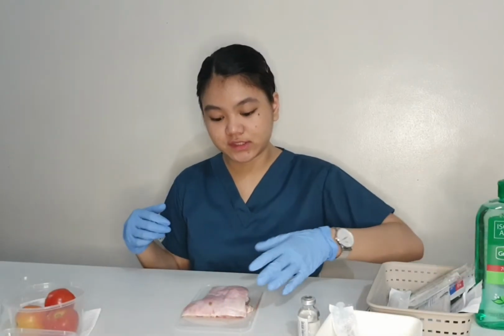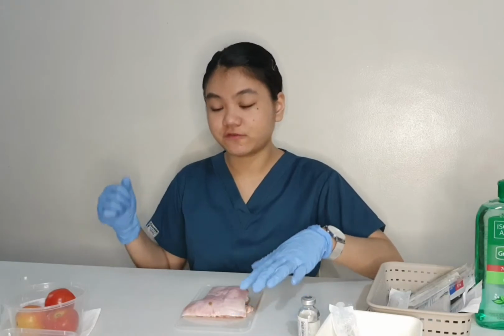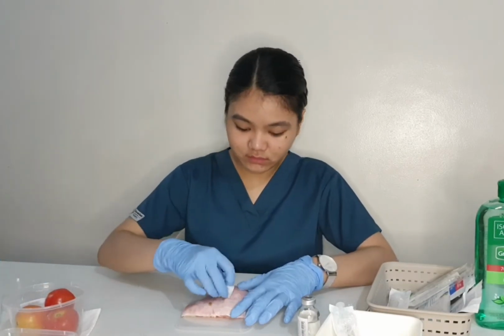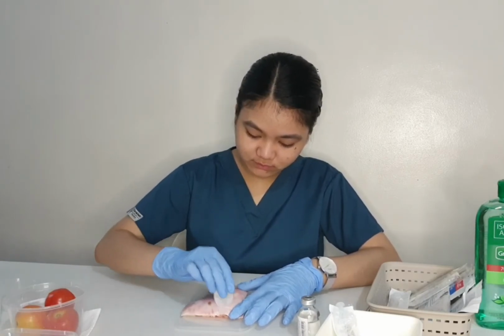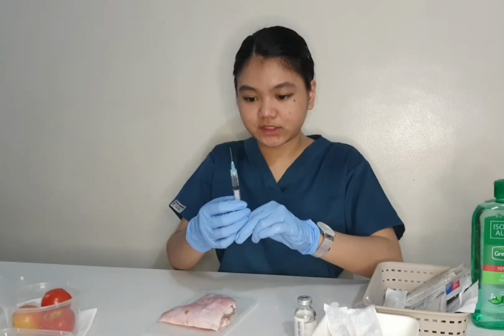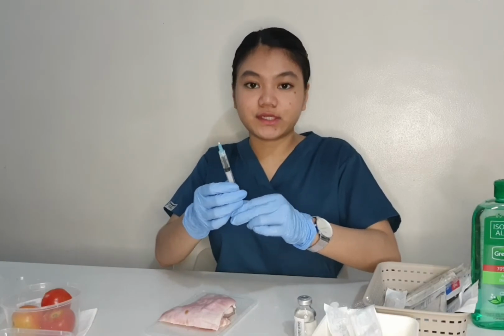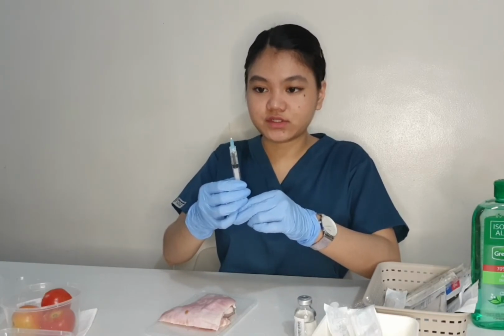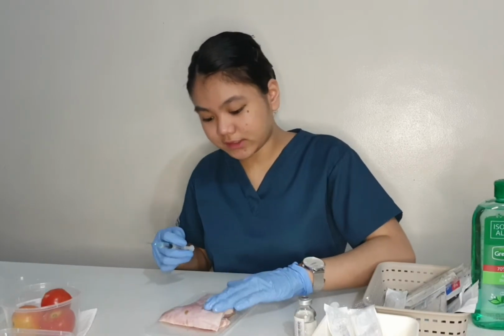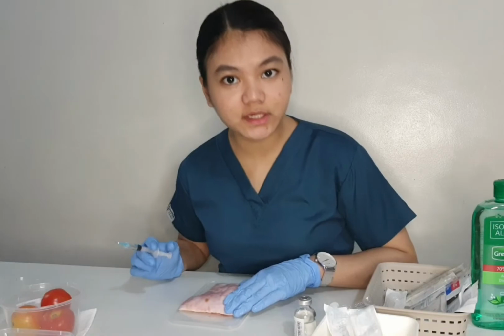Let's start now with the intradermal injection. Before we inject the medication to the skin, let's first disinfect it. Then just let it dry. So upon injecting, let's make sure that there is no air space in the syringe and check if it is working. There you go. Then let's now proceed to the intradermal injection.